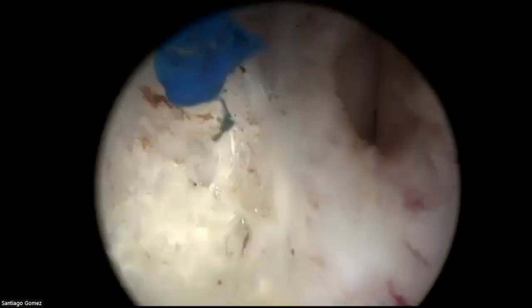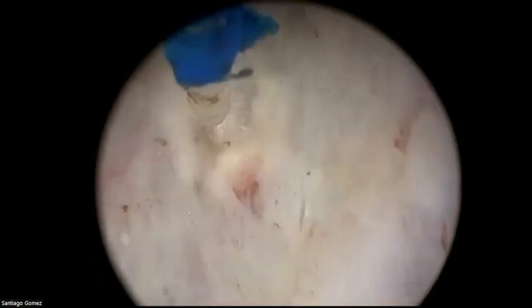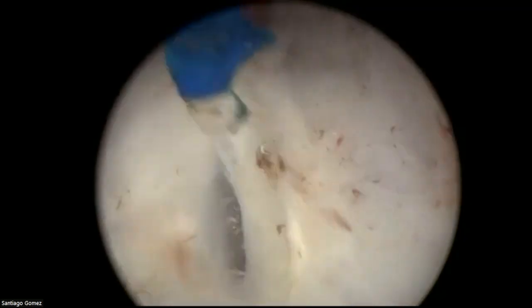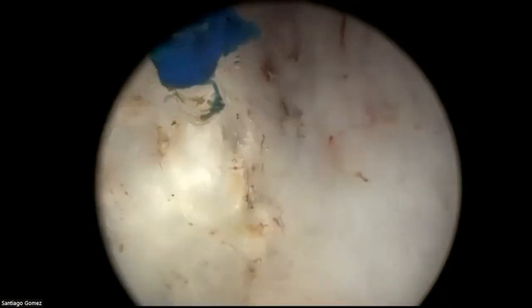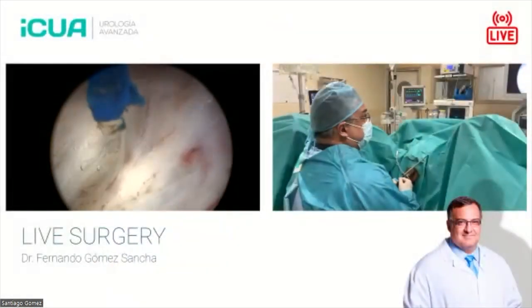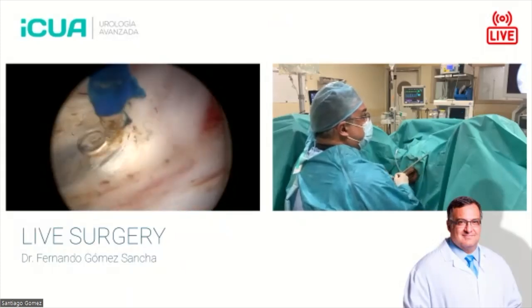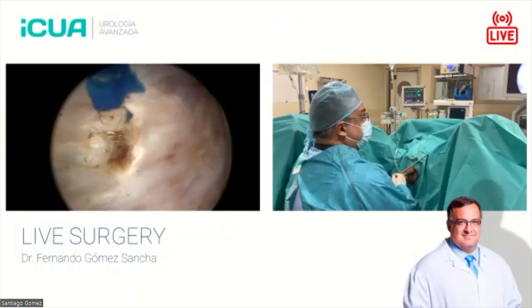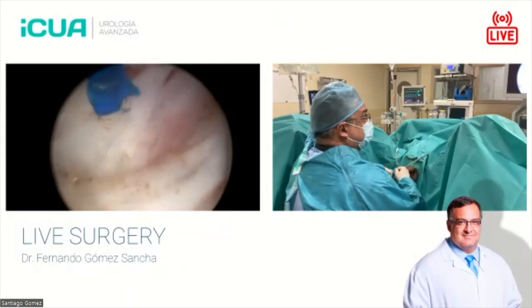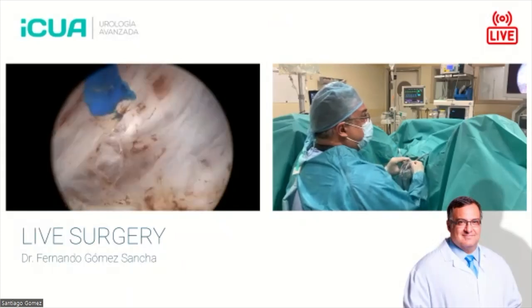Initially, working against the line is absolutely okay. But as the angles of the plane change, you have to change your aiming, and you have to do like a motorbike driver. When a motorbike driver wants to take a curve, what does he do? He tilts towards the curve. And here we have to tilt towards the curve as well. So the fiber has to get closer to the tissue or to the adenoma, so we can continue with our dissection.